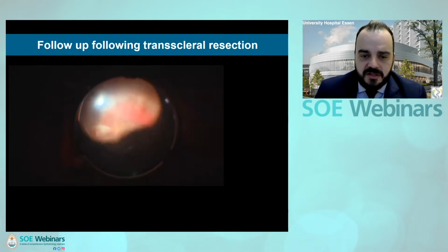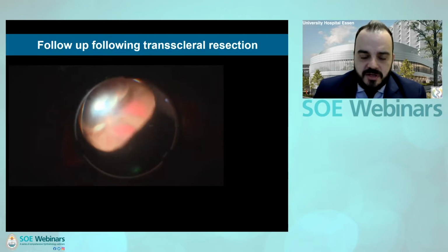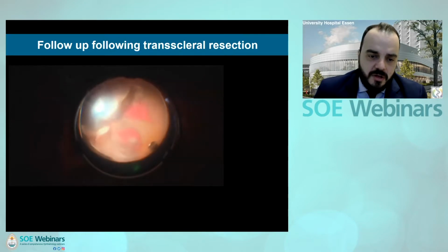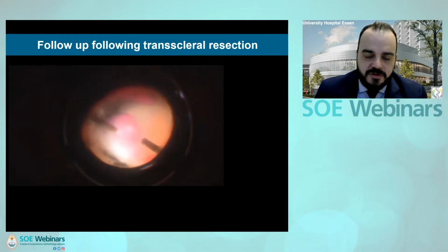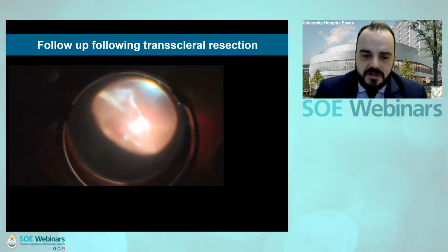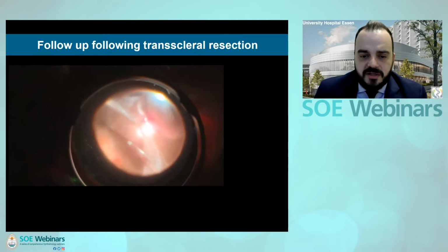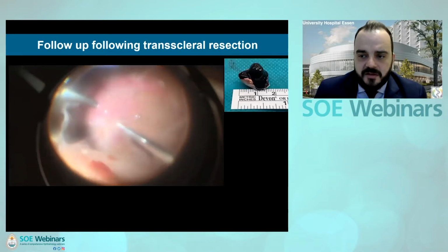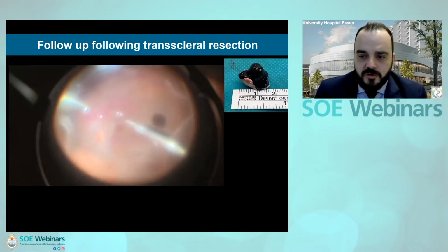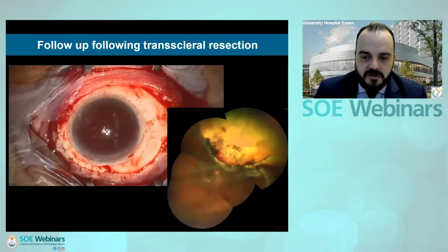So we proceeded a couple of weeks later with the second surgery, and you can see here, after doing the phaco, we proceed with removing the vitreous. Here is the infiltration of the vitreous of the retina as well, working subretinally to remove the subretinal blood, and then proceed with heavy liquid, laser all the way around, and silicone oil. And this was the tumor we removed from this eye, and that's how it looks a couple of weeks afterwards.